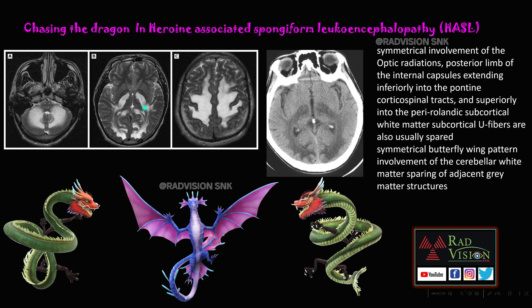There can also be involvement of the bilateral pontine corticospinal tracts and even the periventricular deep white matter or perirolandic subcortical white matter. Here you can see there is symmetrical involvement of the posterior limbs of the bilateral internal capsules and also the optic radiations. These hyperintensities mimic the dragons.